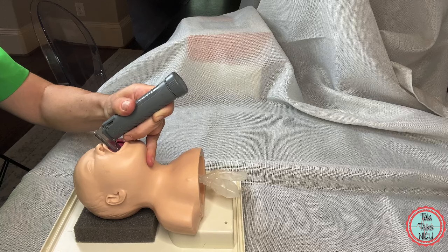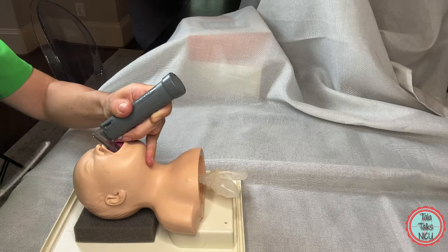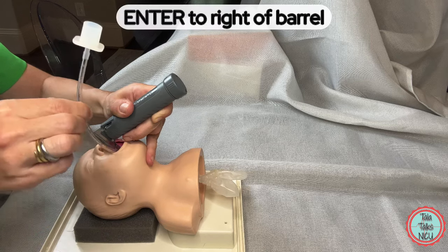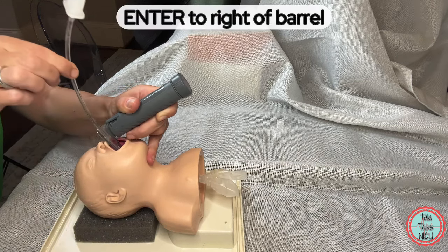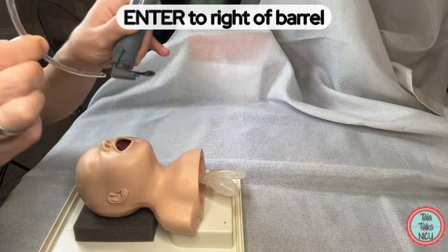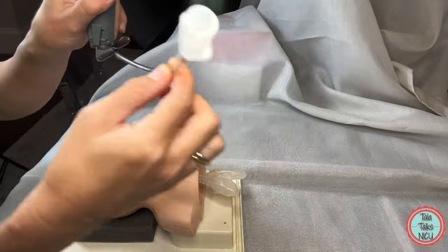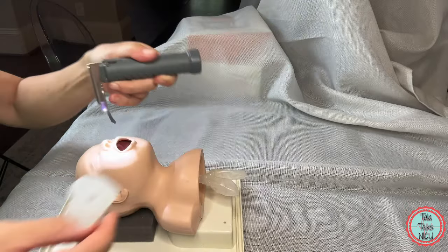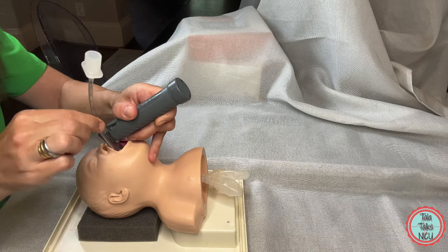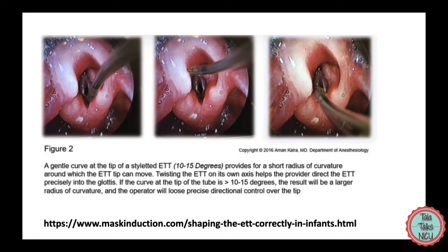Now, with a perfect position of the vocal cords, put the tube in on the right side of the mouth. Don't put it down the middle of the barrel because you'll lose your view of the vocal cords — go in from the side like that. Put the ET tube down on the right side and thread it through the vocal cords until it's far enough down.